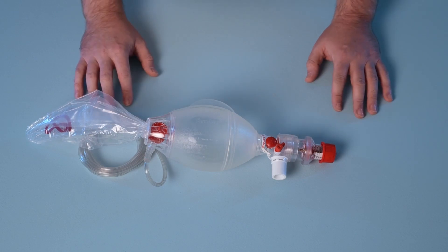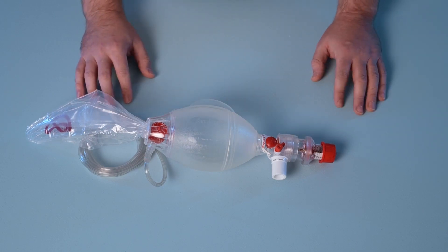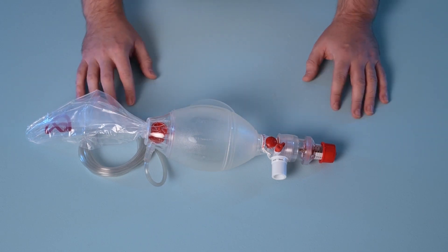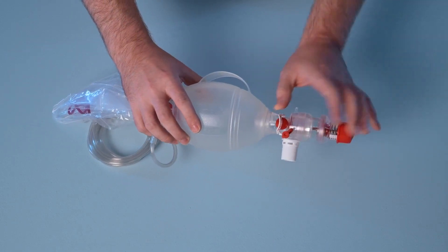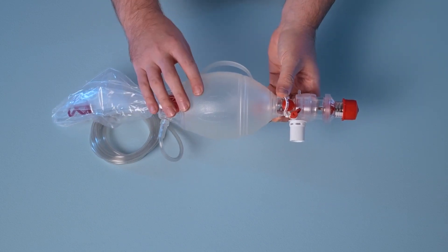Prior to using the Spur2, a pre-use check of the pressure limiting valve is required. So to check the functionality of the valve system, simply engage the override cap to prevent the pressure limiting valve from activating.